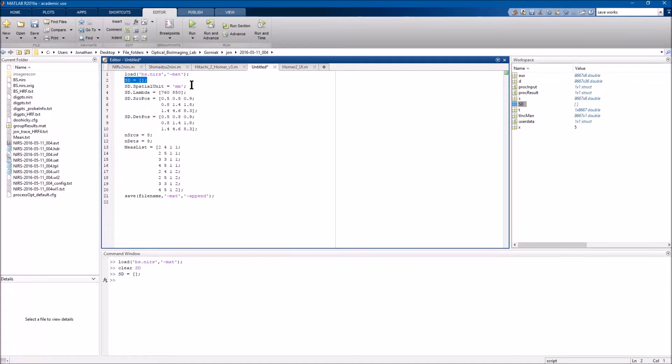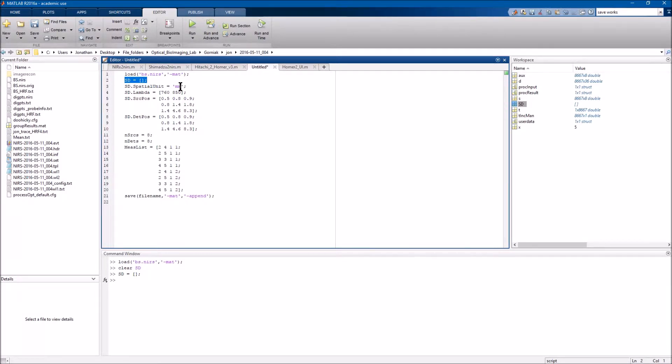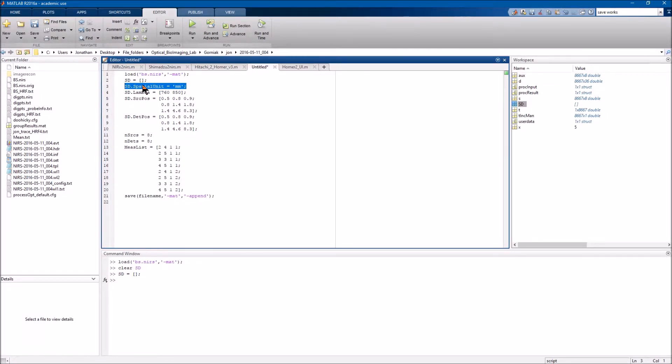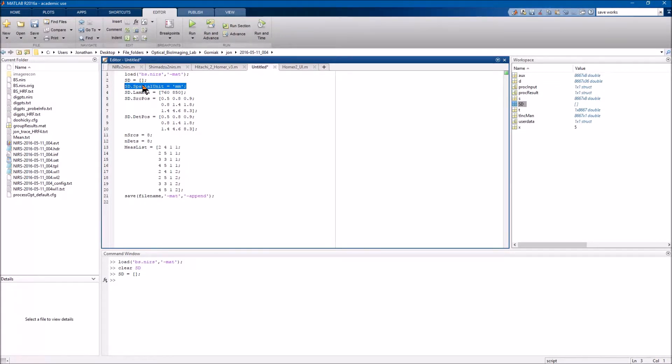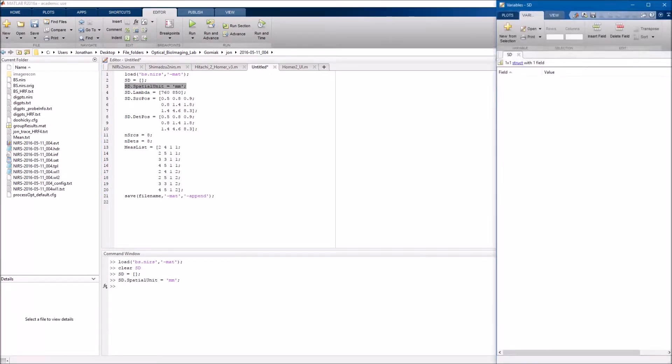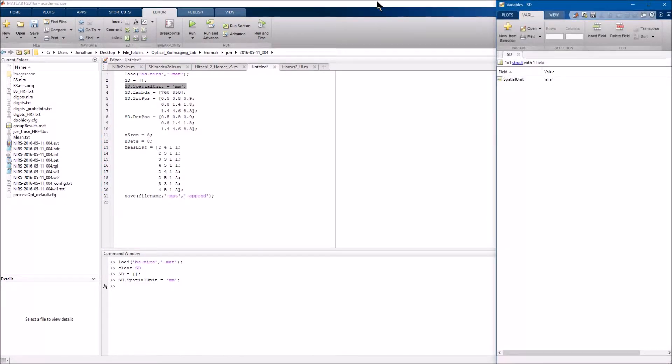Now I'm going to create some units in it. So first off you have sd.spatial unit. This I have set to millimeters. It's either going to be centimeters or millimeters. But if you do plan on using Atlas Viewer at any point, Atlas Viewer does expect millimeters. So do make sure that first off that you have this implemented in millimeters, but also that that would be correct. So in your data itself, if it was originally in centimeters or originally in inches or something like that, you'd have to obviously convert it into the correct unit. So I'm going to go ahead and create that and now you'll notice when I open this up that I have a spatial unit.